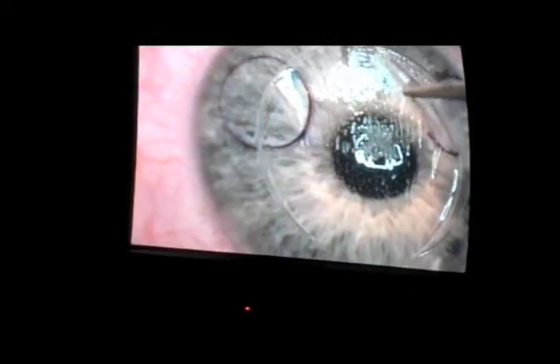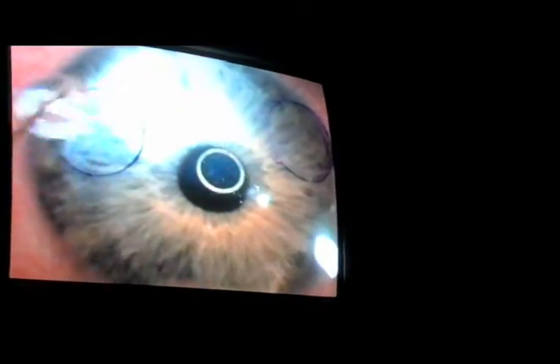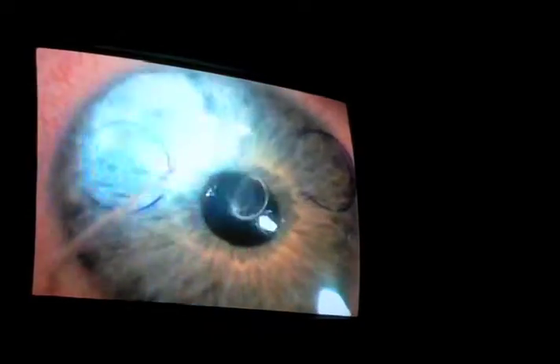Same procedure, from loosening that flap, locking my head into place, and letting the computer get a fix on my eye, and it's another 40 seconds or so as the laser works. This time I did smell a little bit of a burning type of smell, but it wasn't hot. Again, my eyes are totally numb from the drops they put in way back at the beginning. And after the laser's done, he puts the flap back into place, smooths it out so there's no wrinkles. We wait for another minute or so to make sure everything looks okay, and we are pretty much done.